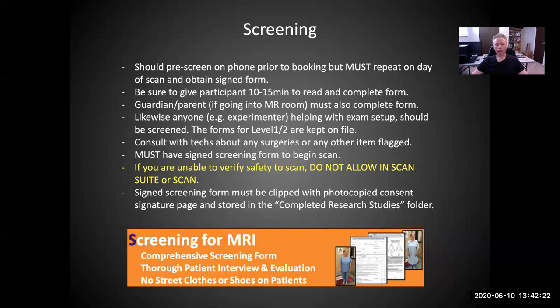Now, if there are any surgeries or other items that are flagged on this form that you know are possibly going to be an issue, then you should consult with a technologist or an operator who should be able to answer your questions depending on their level of training. But we must have a signed screening form to begin a scan.